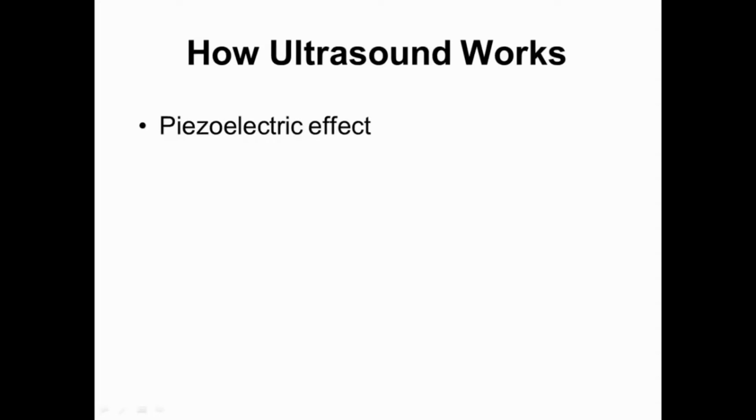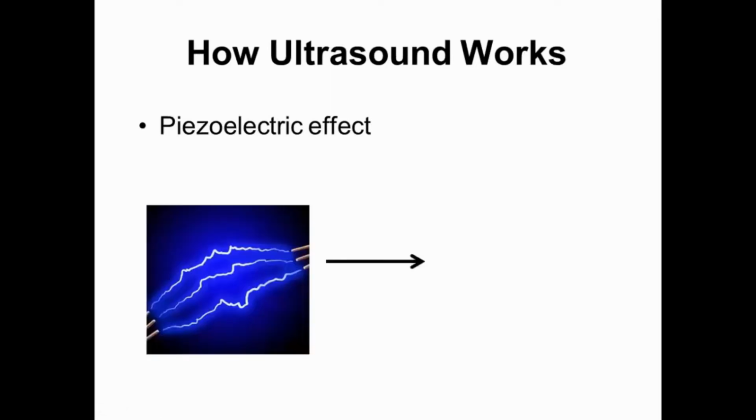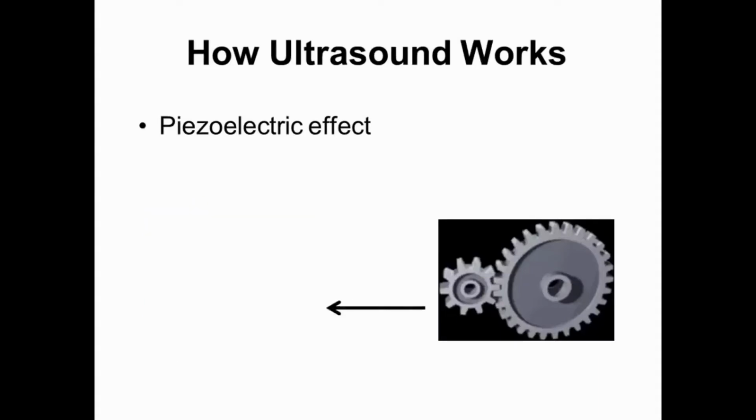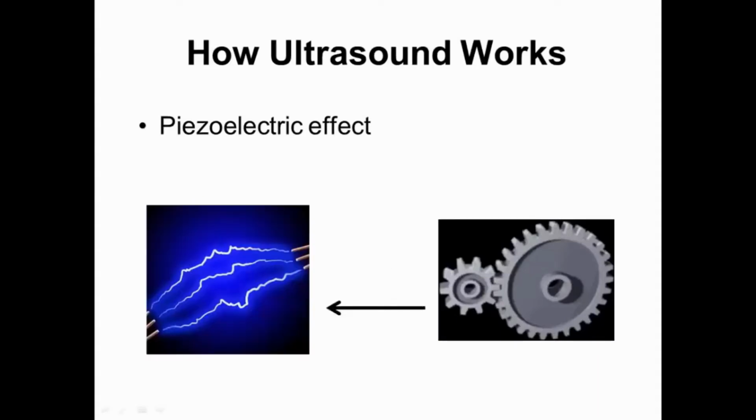The foundation of medical ultrasound is the piezoelectric effect, which is a relationship between electric and mechanical forces observed in certain substances, including ultrasound crystals. When electricity is applied to a piezoelectric substance, mechanical change is observed. The reverse is also true. Mechanical distortion of a piezoelectric substance causes electrical charge in that substance. This reversible exchange is how the ultrasound machine interacts with tissue to provide images.